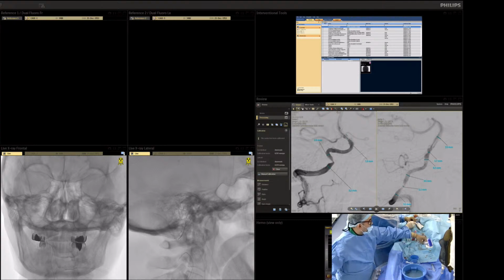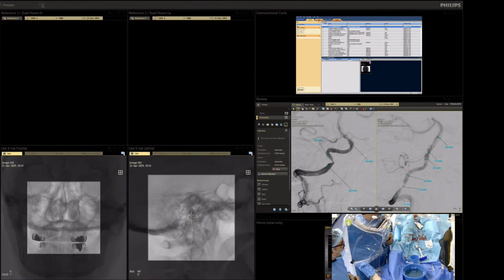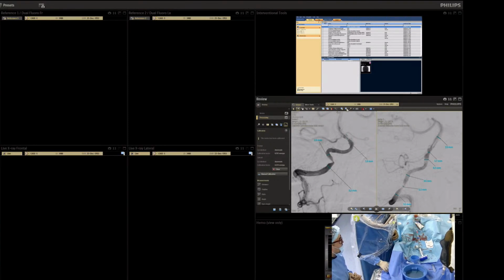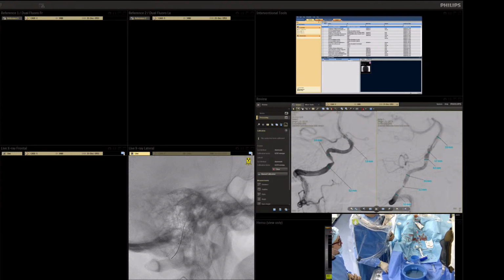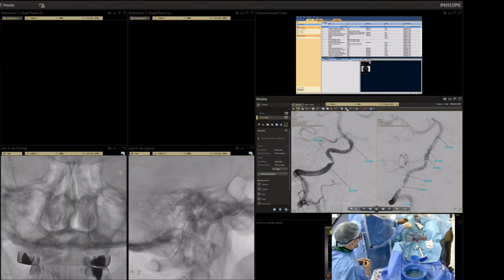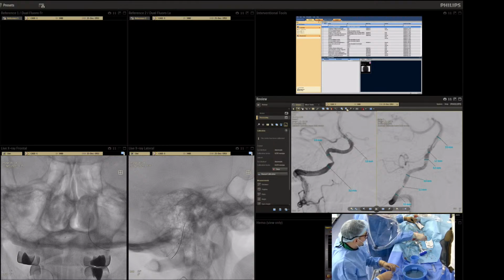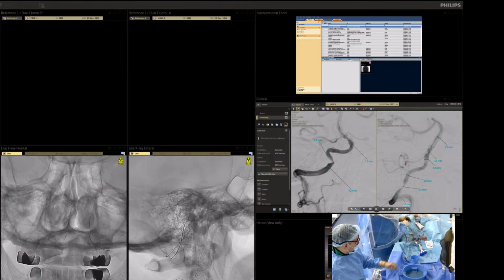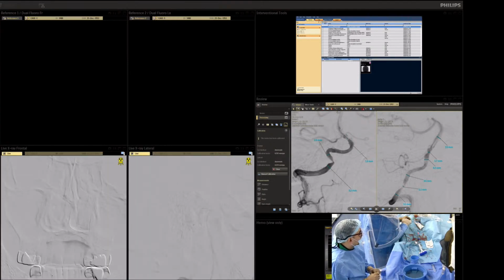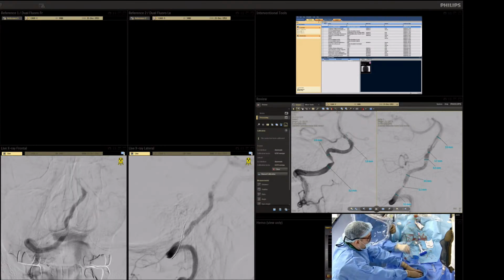I think it's here. Just a second. With the maximum magnification. We can take this. It's not necessary. Yes.